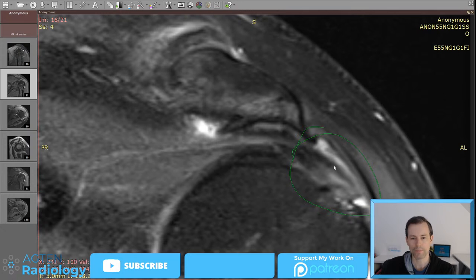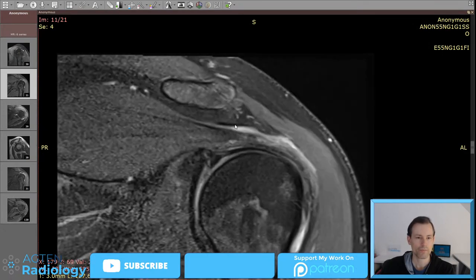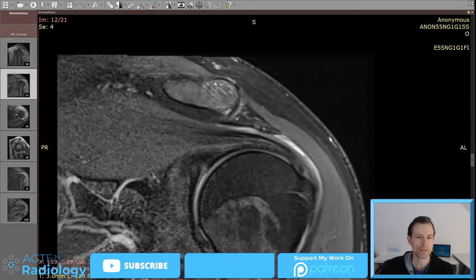You will probably injure your tendon at some point. You will get bony reactions at the facet, at the middle facet, etc. So it's always good to make out these kinds of osteophytes, because if they go in and do surgery, they will have to resect these, so they just cut them away, basically.